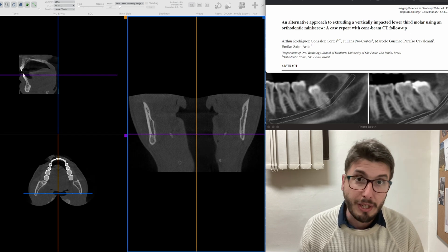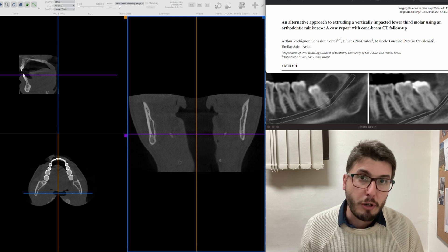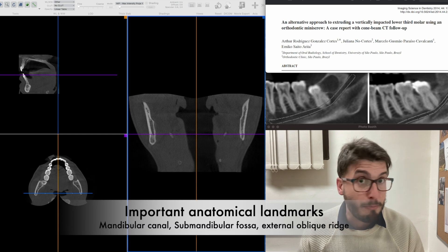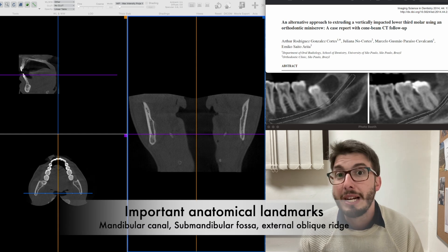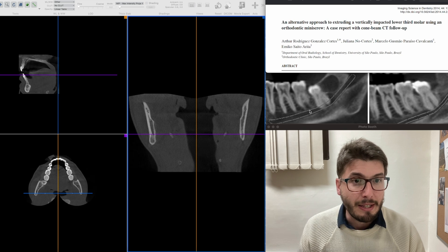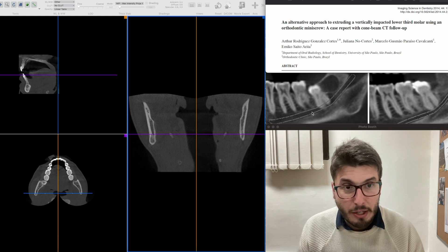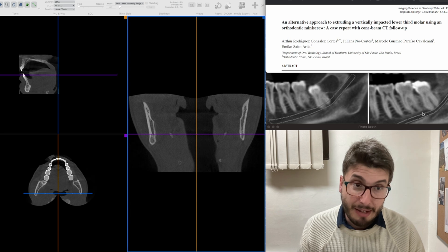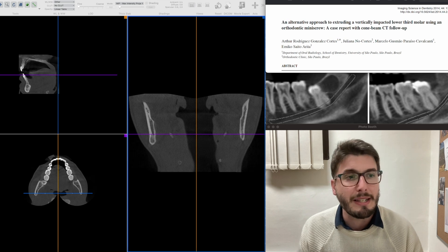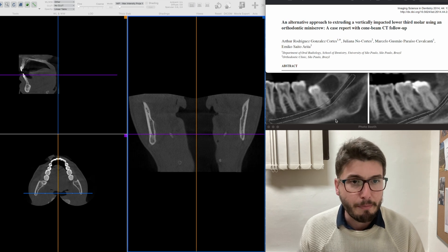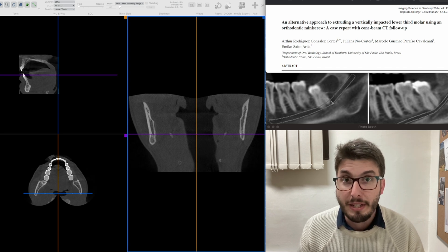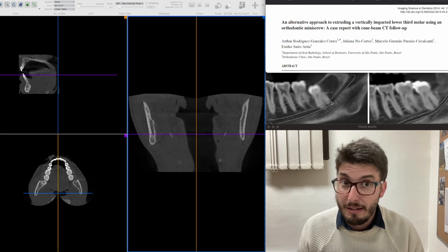CBCT is recommended for all cases since we need 3D information to perform the surgical plan properly. We have very important structures to diagnose in relation to the lower third molar, such as the mandibular canal — which contains the inferior alveolar nerve, though remember we see the canal itself in CBCT, not the nerve — and also the submandibular fossa on the lingual aspect of the mandible.